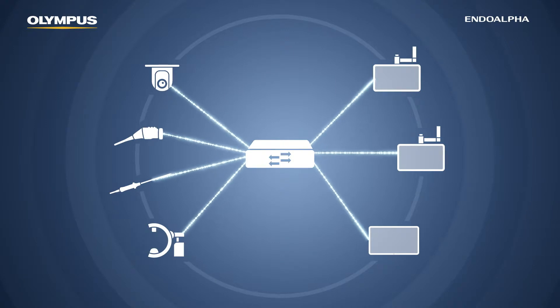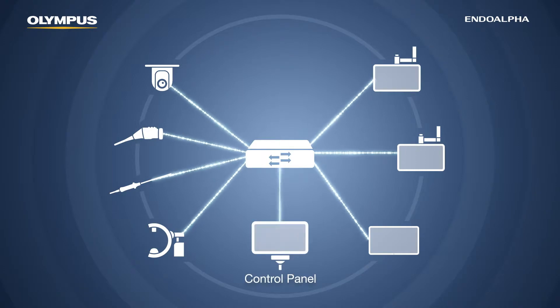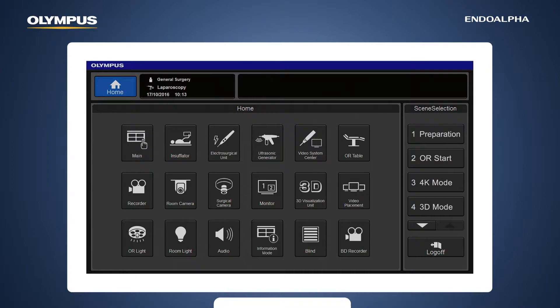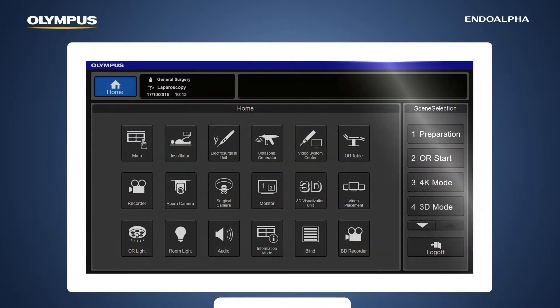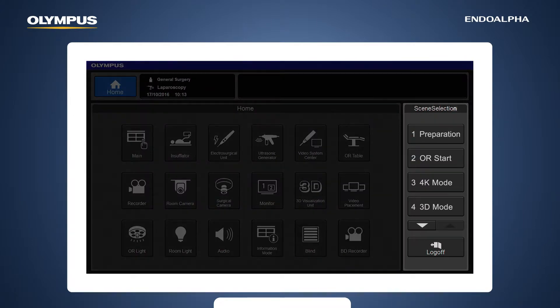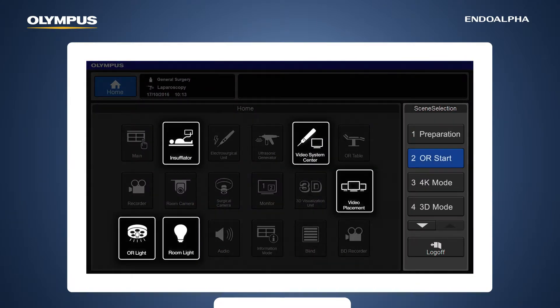Central to Olympus OR integration is the IndoAlpha control panel. This simple and intuitive home screen allows OR hardware and software to be harmonized, while scene selection allows simultaneous activation of multiple devices without moving around the OR. This saves time and reduces device setting errors.